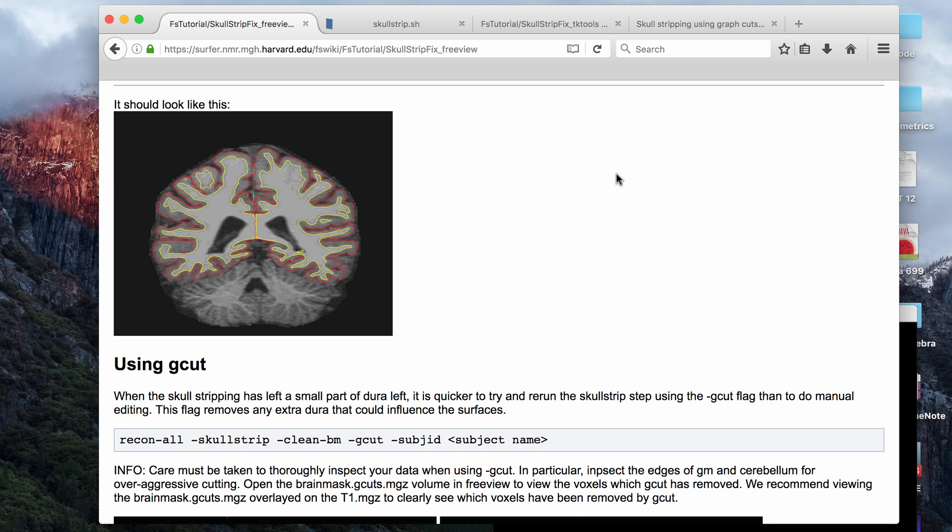Hey guys! In this video I'm going to finish going over how to fix a bad skull strip, so this will probably be the last video in this little series.